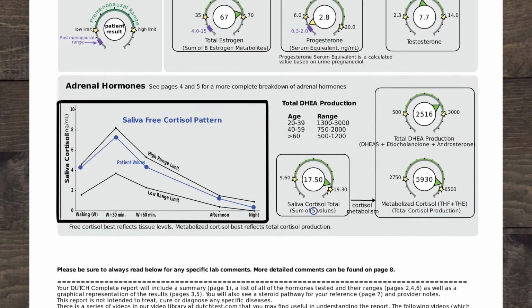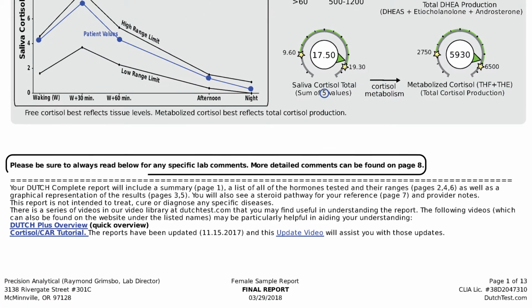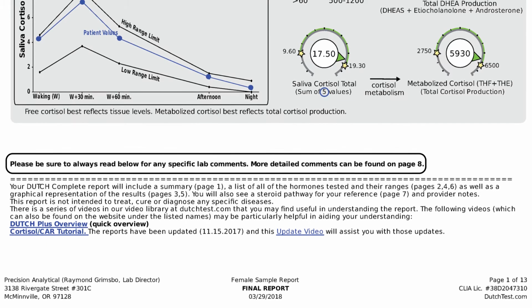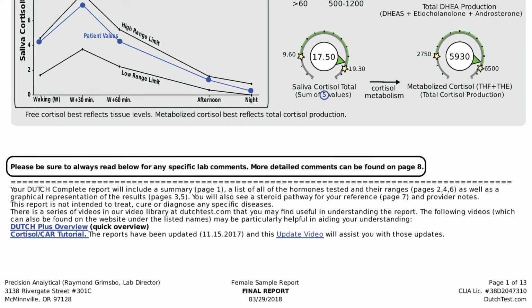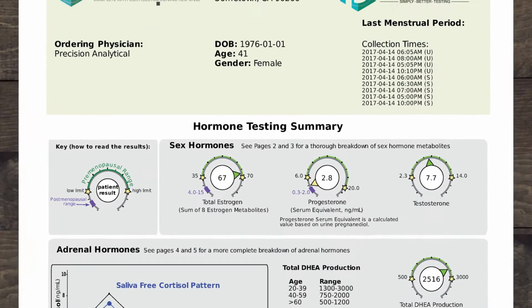As you go down further, you'll also find some space for information for us to communicate to you if there's something particular about these results that needs to be noted. So you can see those in this space here, and then there'll be much more elaborate notes further on after the results in the provider notes section.